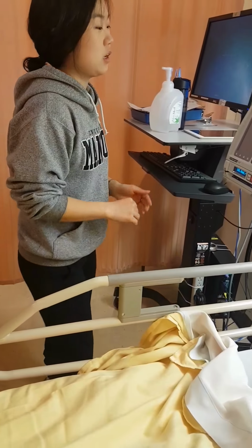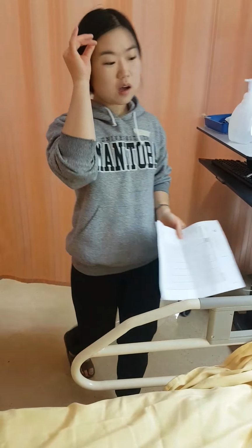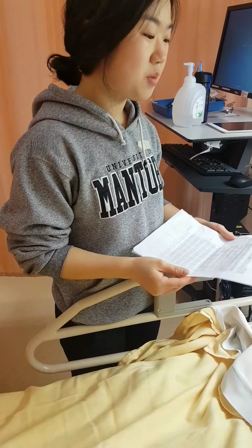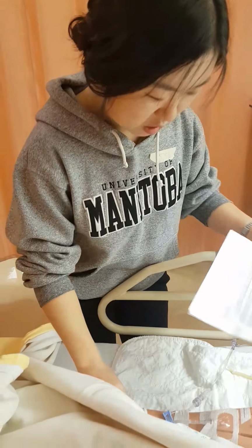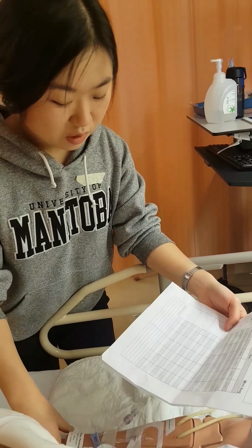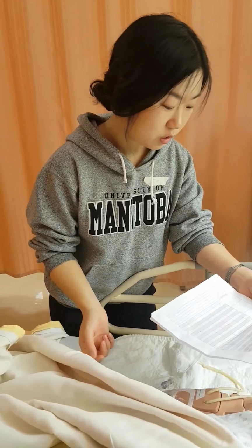Yep. And it's running. Okay, so, hello, Mr. Smith. I'm Sol, and I'm a student nurse, and I'm going to be administering your meds today. Can I please look at your ID, or patient ID band? Thank you. So, can you tell me your name, your birthday, and if you have any allergies? John Smith, date of birth, and you have no allergies.